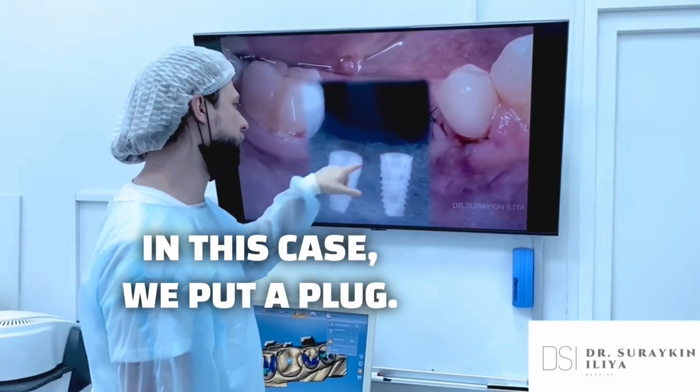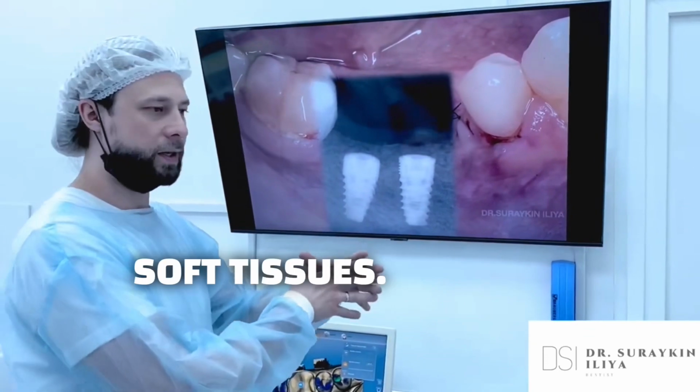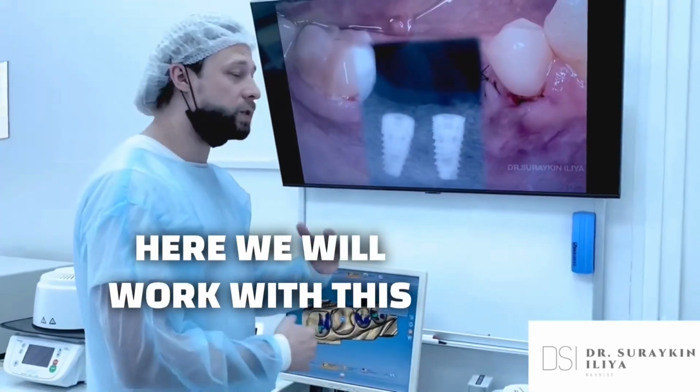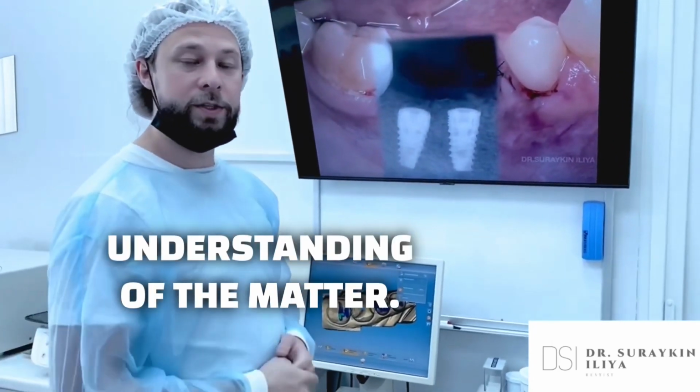In this case we put a plug. I want a small amount of bone tissue on top. In the future, according to the plan, we will add soft tissue. We will take a transplant from the palate. We will plant it in this area so that there is a lot of gum, and it is thick. Here we will work with this point. Therefore, install implants with a high quality and understanding of the matter, and you will be fine.